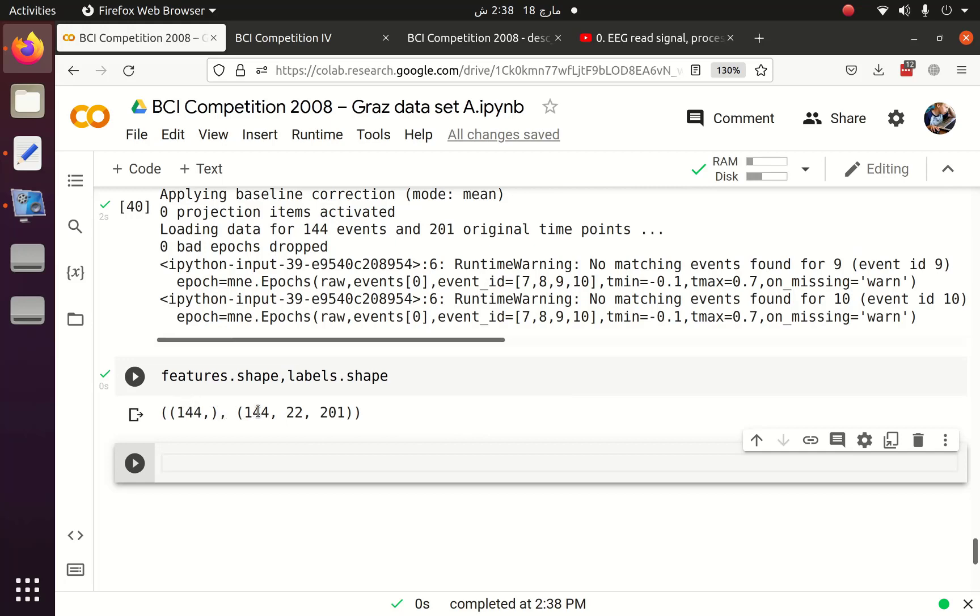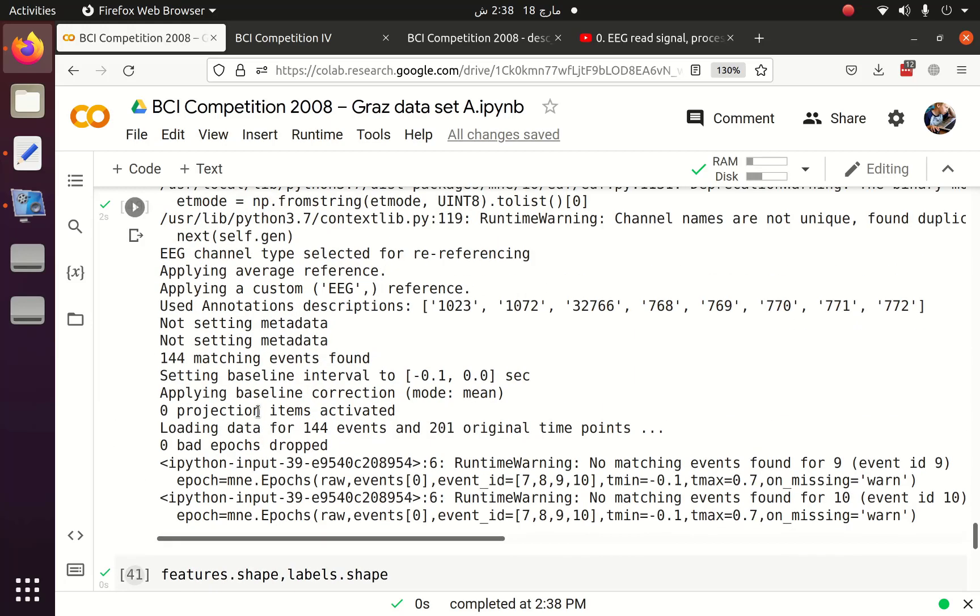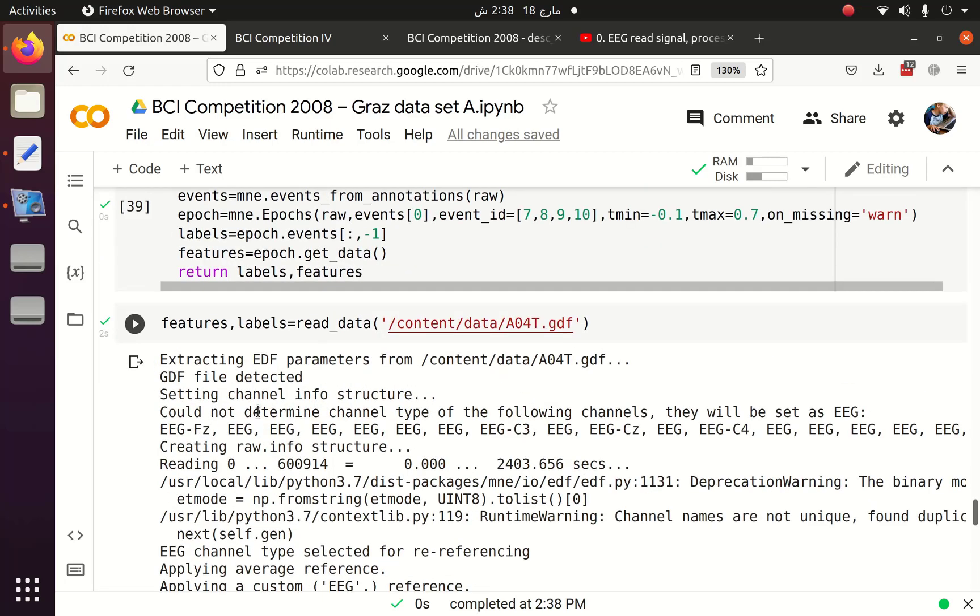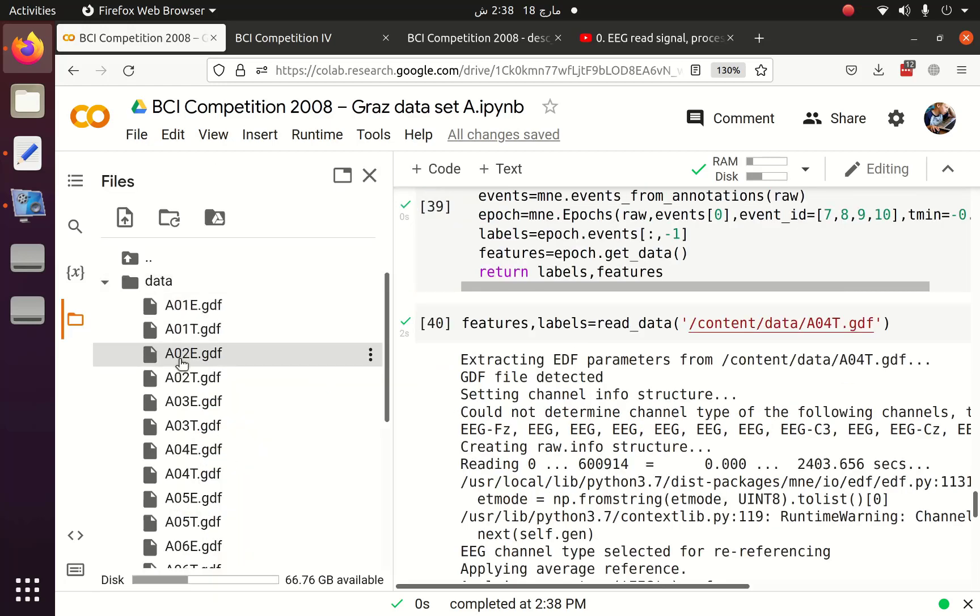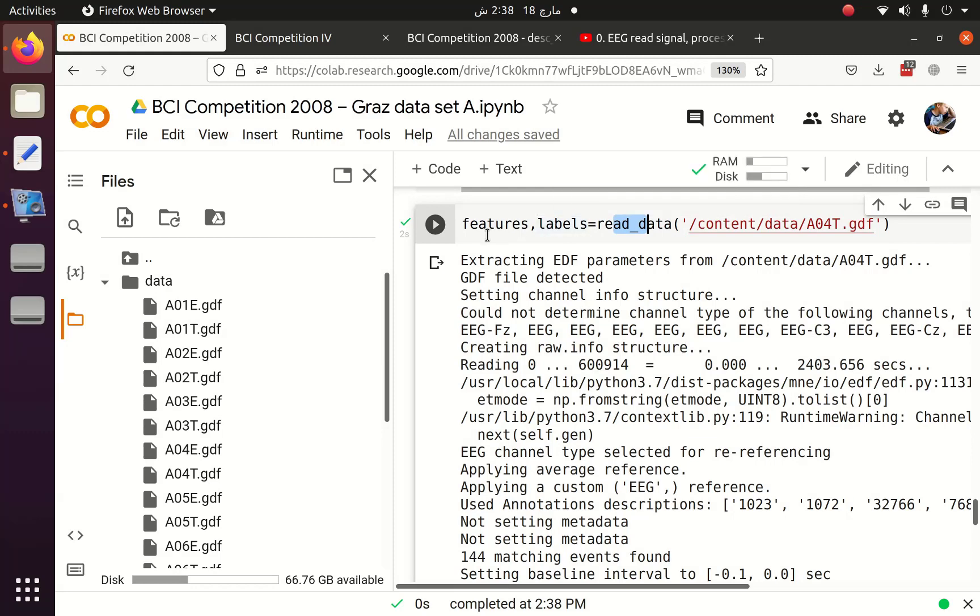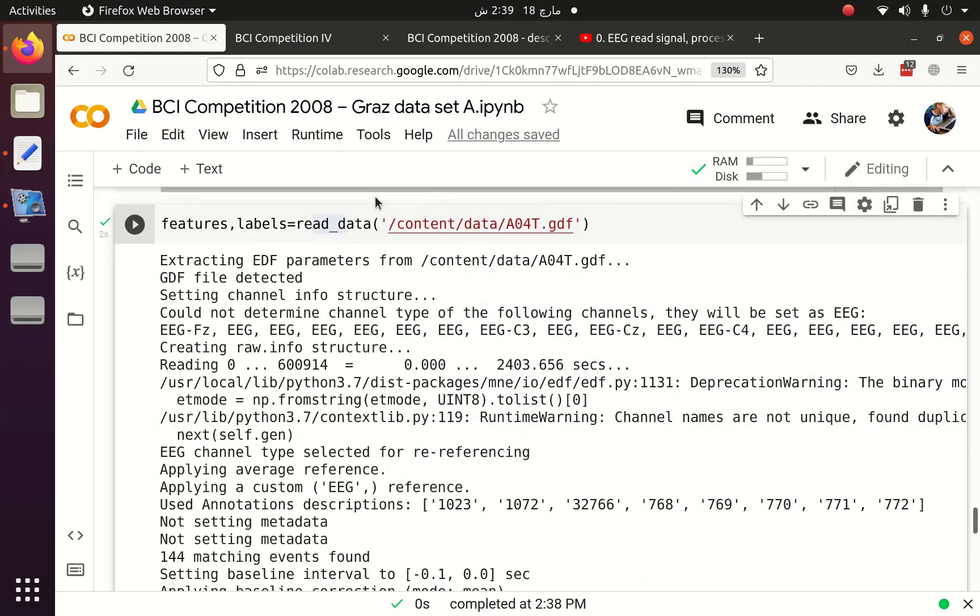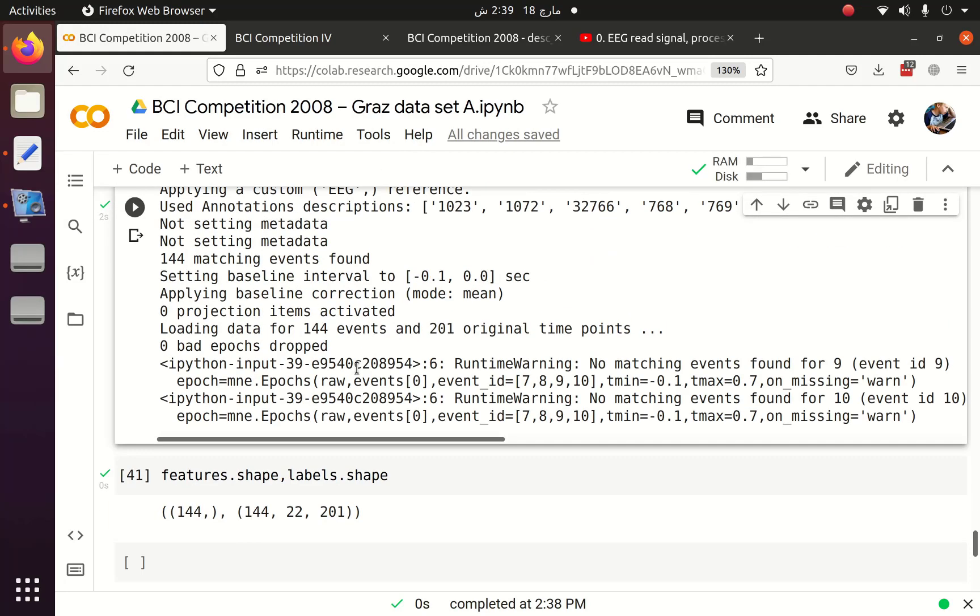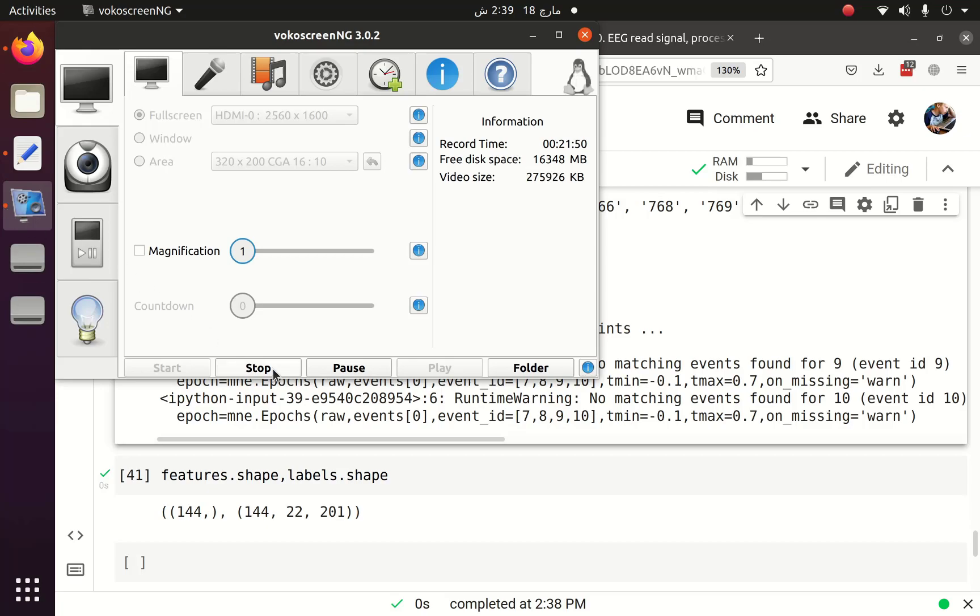And this is the end of this tutorial. What you have to do is that you have to loop each of the file and then you have to pass it to the read function. Once you pass it to the read function, you will get the features and labels of each file. Then you have to concatenate the features and labels into one array. This is the task at your end, and I hope you will like this tutorial. Thank you.